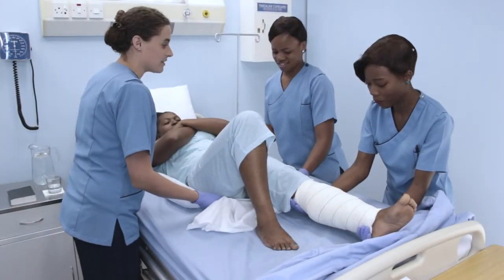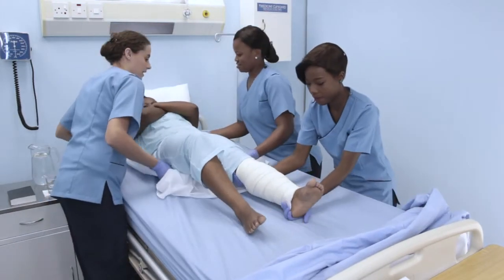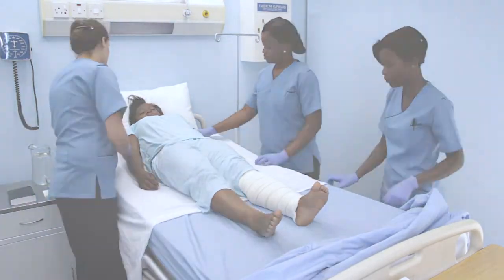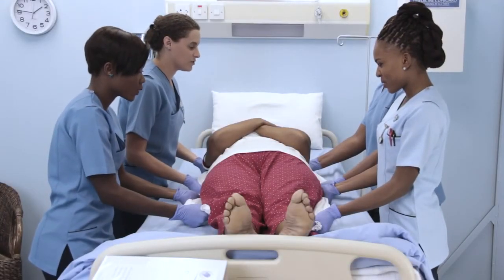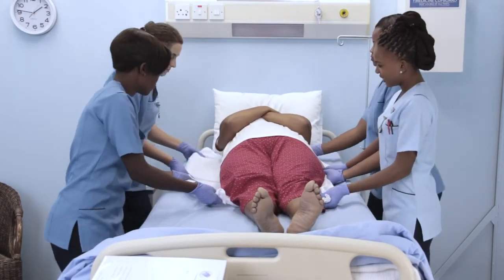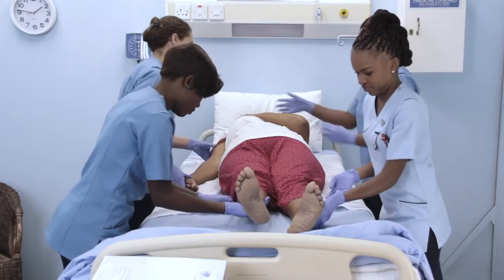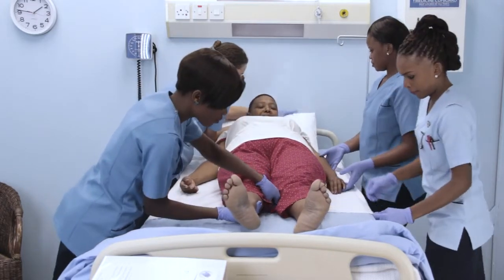When moving a patient with a leg or foot problem, such as a cast, wound or fracture, one extra care provider should be assigned to lift and move that extremity. When the patient is unable to assist or the patient is too heavy to be moved by two people, assistance should be given by at least two more care providers. Thus, having care providers at both shoulders and the hips on either side of the patient.